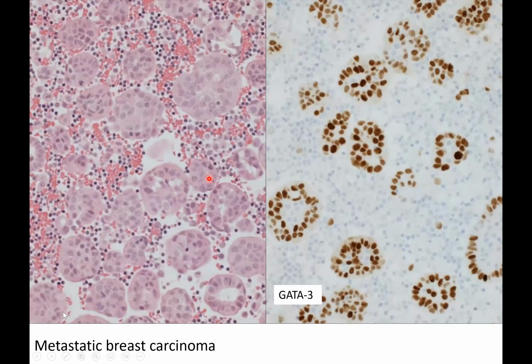Here we can see these glandular clusters on the cell block, and they stain positively with GATA3, confirming metastatic carcinoma of the breast. And these very typical cannonball clusters can be almost diagnostic of breast carcinoma.